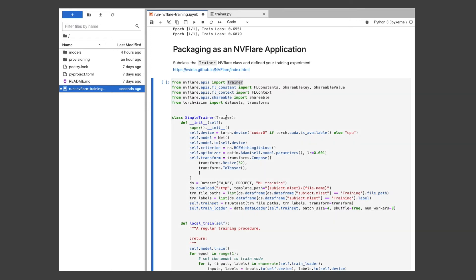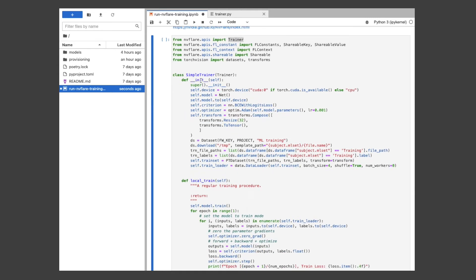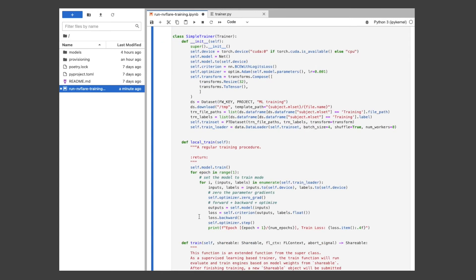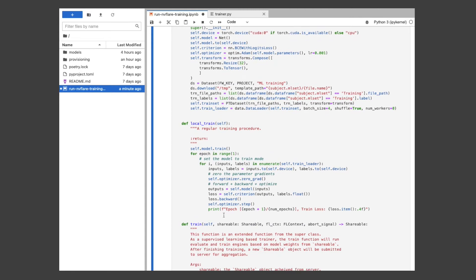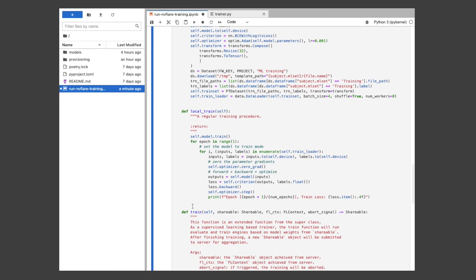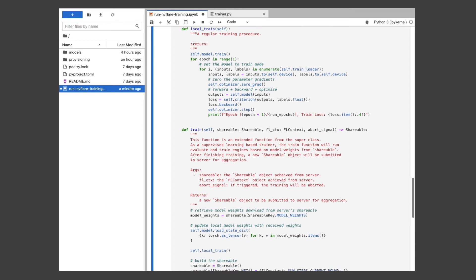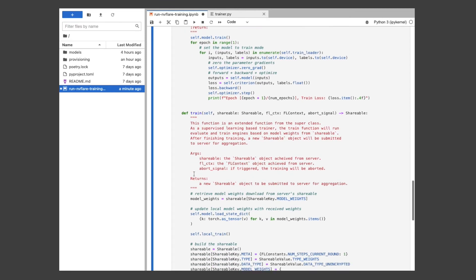With the trainer class, we have the model definition as well as our dataset and data loader, again using the Flywheel dataset API. We define our training loop in the local train method. Finally, with the train method, we define how the client will receive the model and how it will send it back to the server once training is complete.